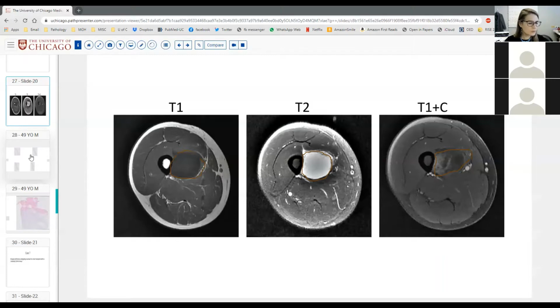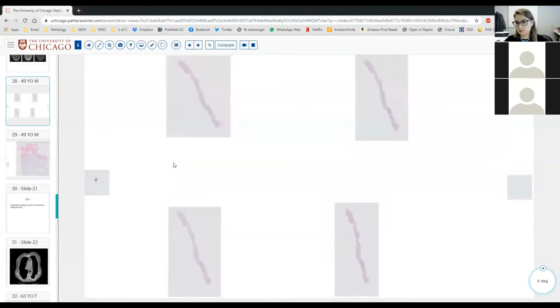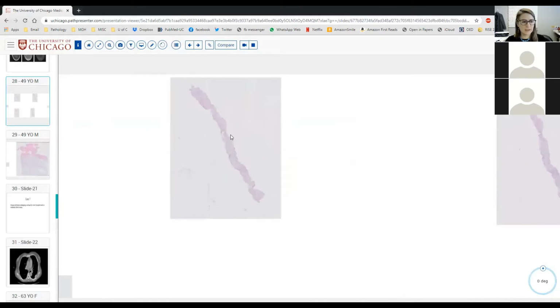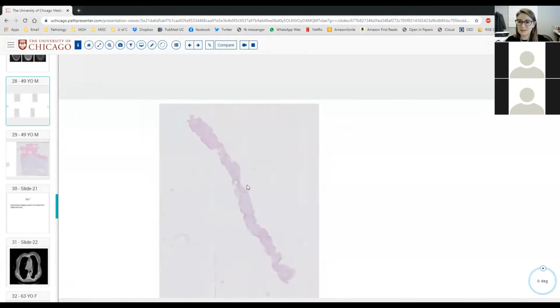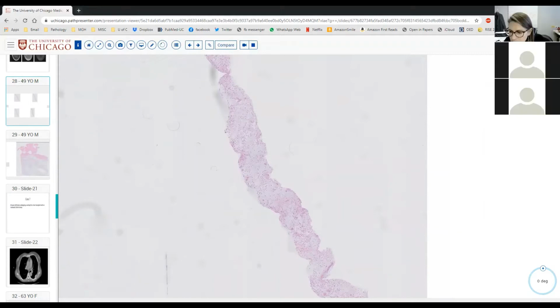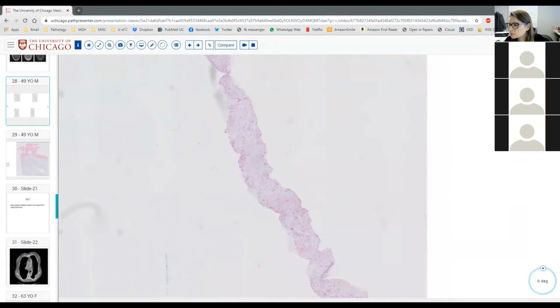Awesome. Of course, anyone with a prior history of cancer, we have to exclude the cancer, right? But based on those imaging findings, it's a well circumscribed, low grade appearing thing with maybe a gelatinous signal. So anybody want to take a gander at this guy? I could describe it. That'd be great.